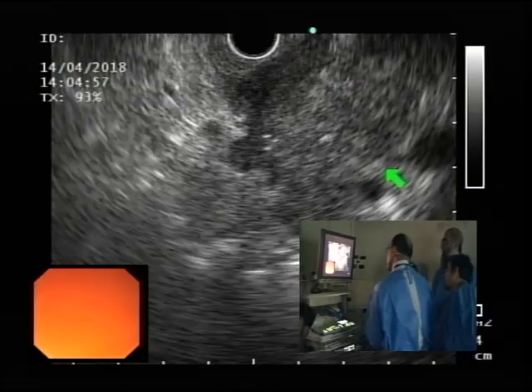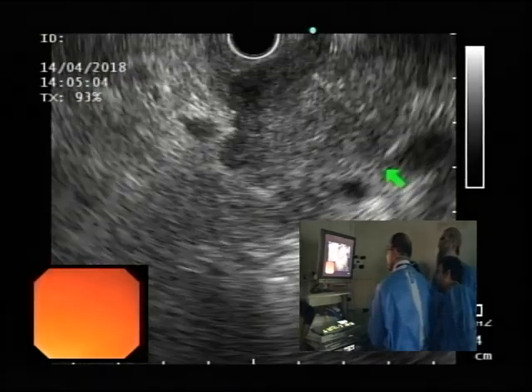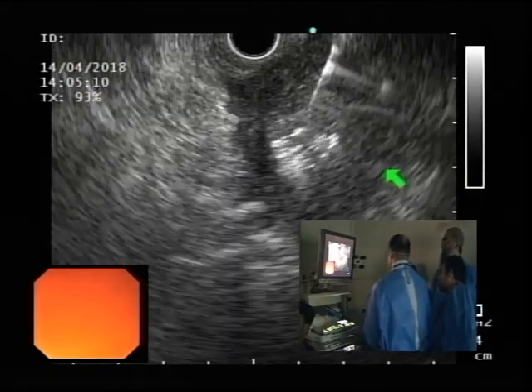उसके बाद unlock किया. थोड़ा सा it's a bit maybe too close to the periphery, but हाँ जी on कर दिया.